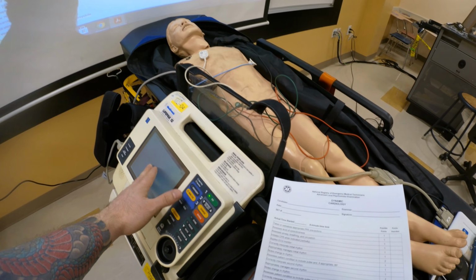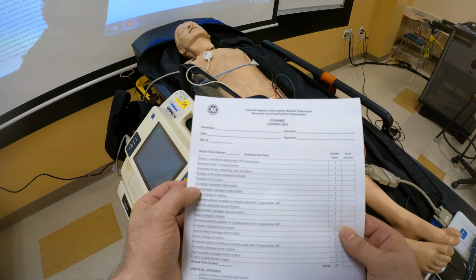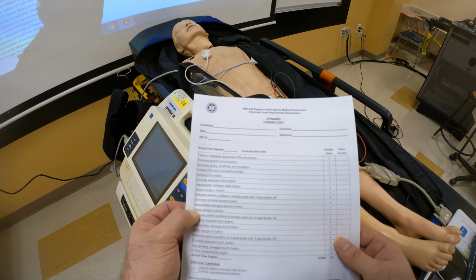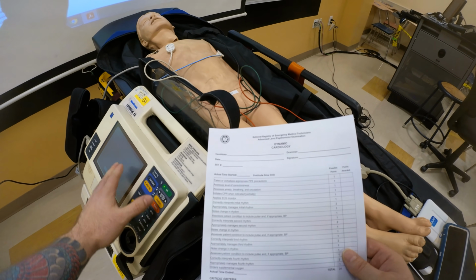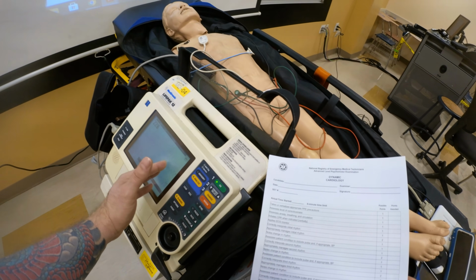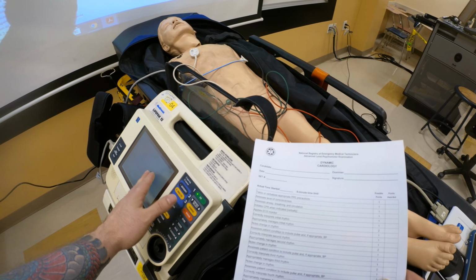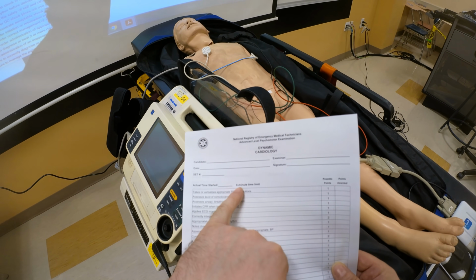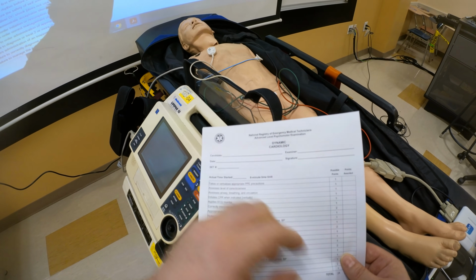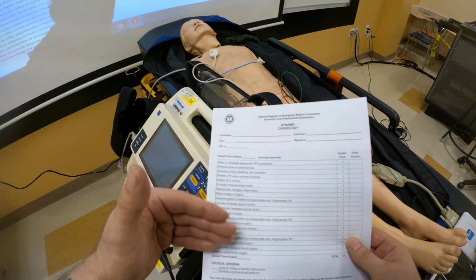And here, because this is testing and on a time constraint, you notice it says notes change in the rhythm. That means that once the instructor has changed the rhythm, the student notes the change of the rhythm, even if it was not 2 minutes since the last shock, and they need to change whatever they're doing. The reason is that, if you notice, it says here 8 minutes time limit. If you have 4 rhythms in 8 minutes and you have to assess your patient initially, you're not going to be able to do this every 2 minutes.